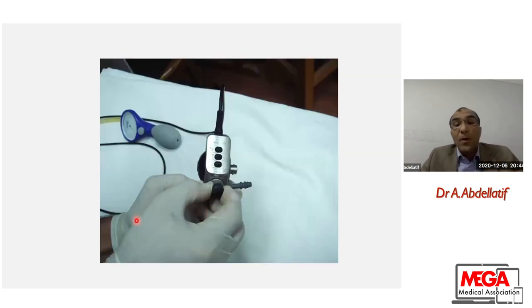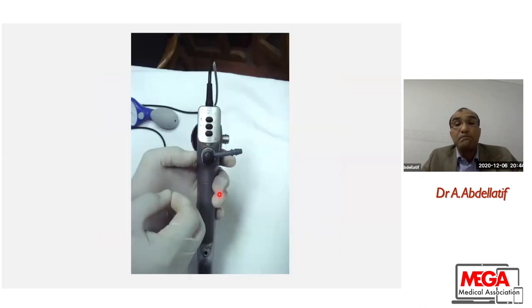Then I will put the suction port in its special place here in front of the handle. And I have to test it by just pressing on it.